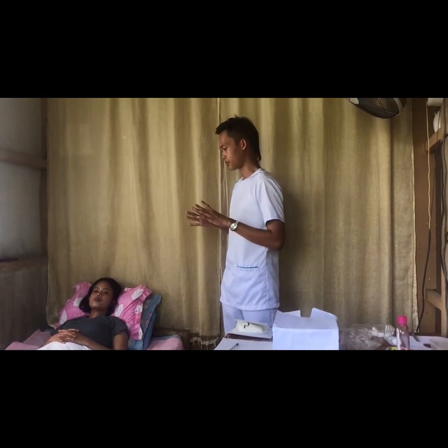Okay. So the first thing that we're going to do for this procedure is to ask the patient his full name. So sir, what is your full name? Lito Butan. Okay. When is your date of birth? March 11, 2000. Okay.